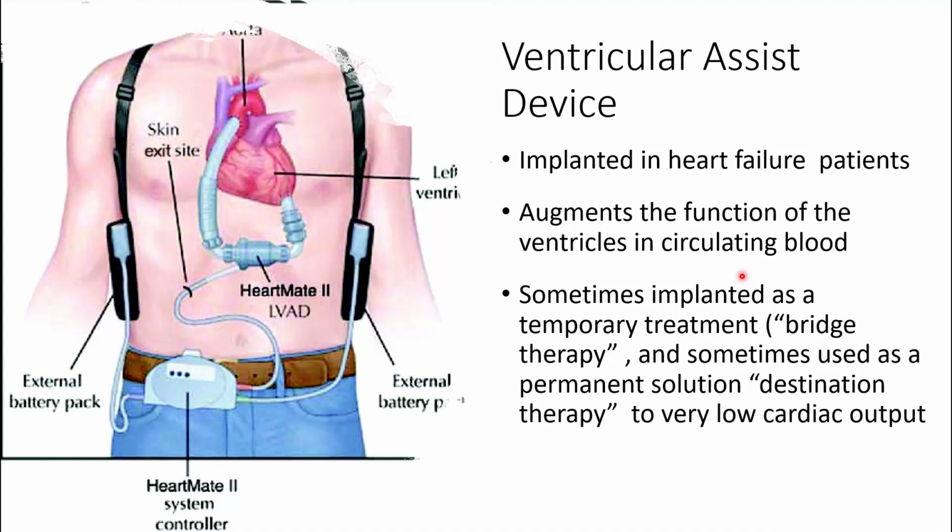One is something called bridge therapy, which serves as a bridge until the patient can get a heart transplant, often to keep them alive or improve their health so they're stable enough to get a heart transplant. Some of these patients are so unstable, they can't survive the surgery. So the LVAD actually buys them time to stabilize so they can actually get a heart transplant.